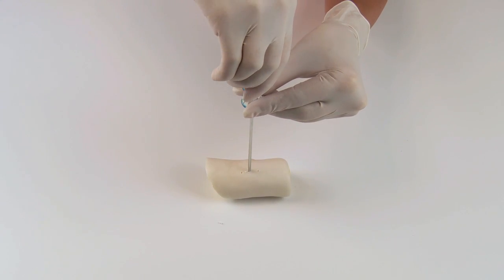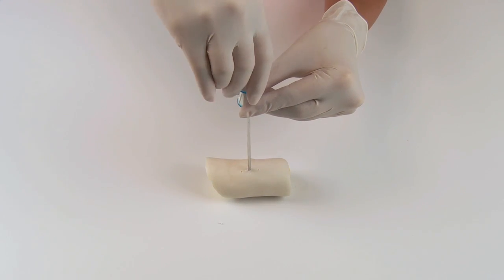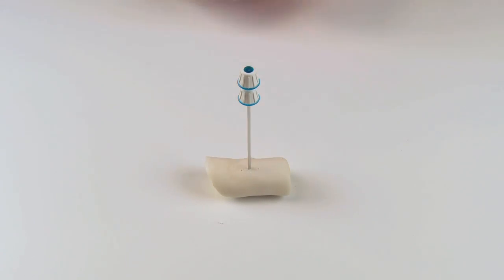When the drill has passed the cortical bone, advance the penetration cannula 2 to 3 millimeters into cortex. Make sure that the penetration cannula is firmly anchored into the bone. Remove the drill.